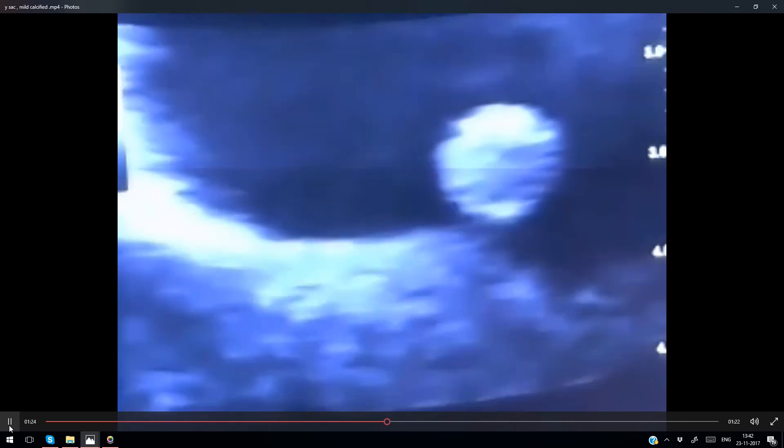I will follow this patient because this fetus is at risk. If I am seeing a good fetal heart rate that corresponds with the CRL, I will go to the yolk sac to see whether it is normal or not. This is a mildly calcified yolk sac — not completely calcified.